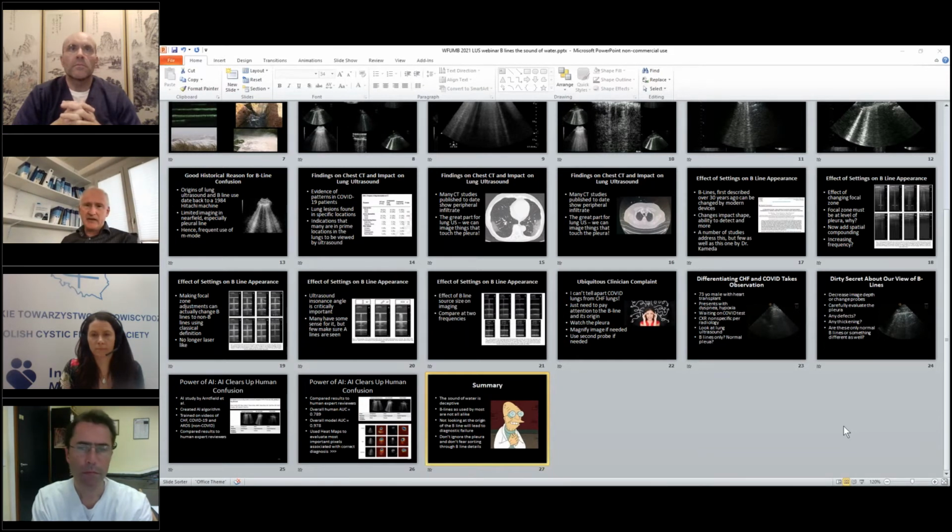They filter me that I should look carefully to the pleural line, as nicely shown by Michael. Then I focus with a high frequency transducer. So it's in between to have an idea, 1 to 2 minutes. And if I go into detail, educate and whatever, 5 to 10 minutes, pretty much the same. Okay, thank you very much.